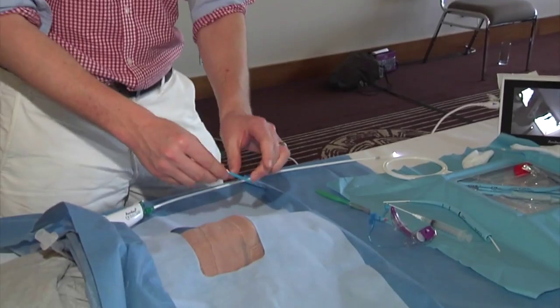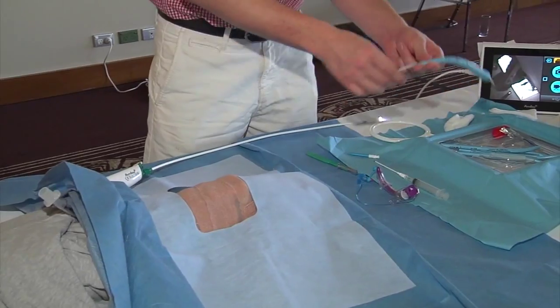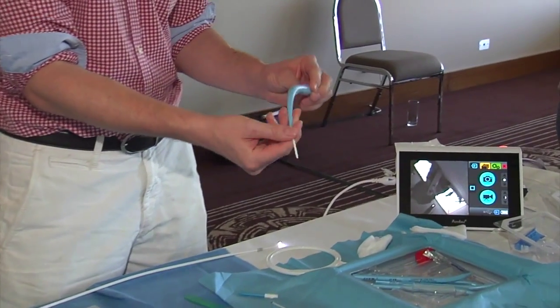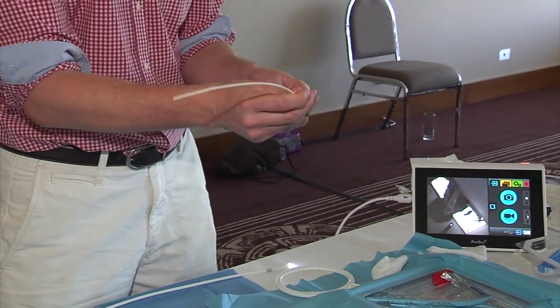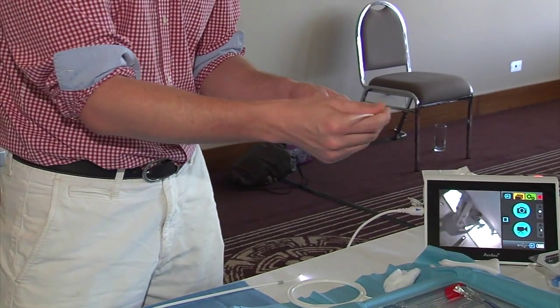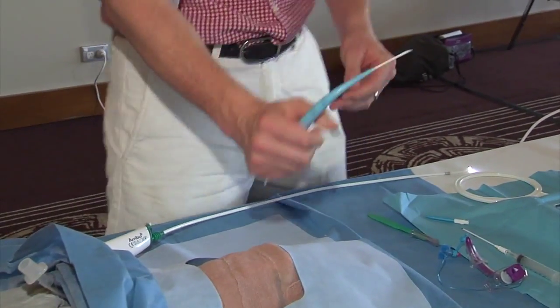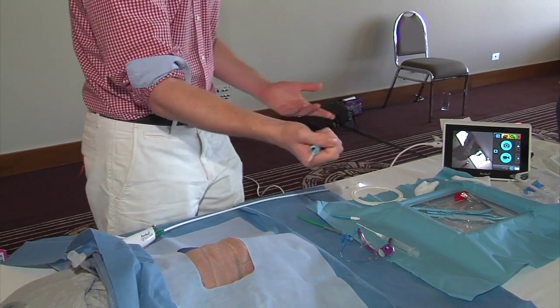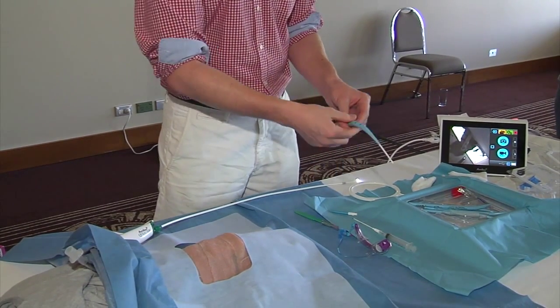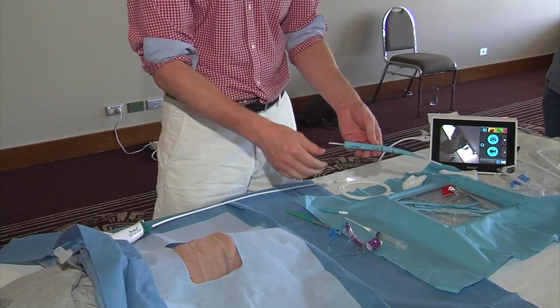Then put the small dilator over the guide wire, in up to the hilt — you can visualise that with the bronchoscope as well. That comes out, leaving the guide wire in. Then take the curved blue rhino dilator with the inner dilator inside it, remembering to insert it from the front rather than the back. Slide it in until it reaches the stop point clearly marked on it. You can use either an overhand or underhand technique — both are equally valid. This is hydrophilically activated, so normally you'd wet it first to make it very slippery so it slides in smoothly.